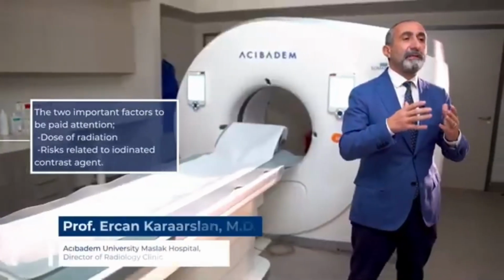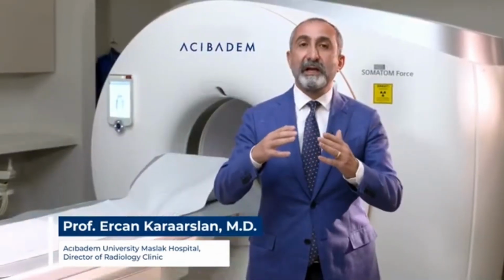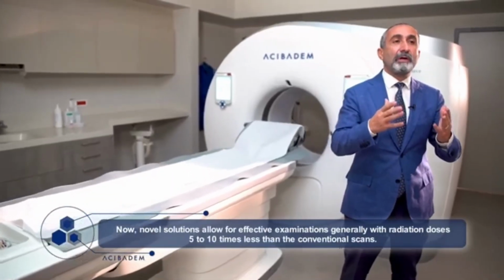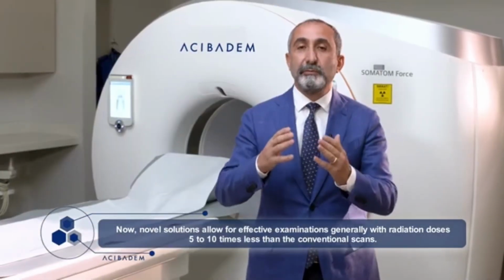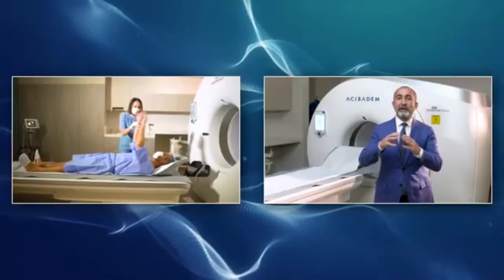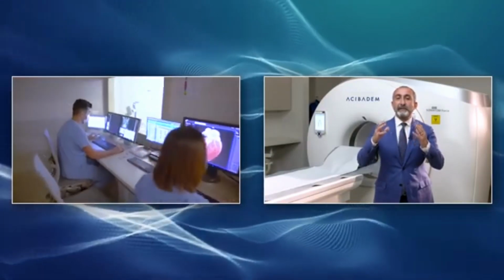Here, the radiation dose and the risk arising out of the iodinated contrast agent require utmost attention. Novel scanners enable very quick scans that may diminish the dose of the contrast agent. Now, novel solutions allow for effective examinations generally with radiation doses 5 to 10 times less than conventional scans. Angiography with computerized tomography is the method that poses the lowest risk to examine the coronary artery and its wall in any patient.